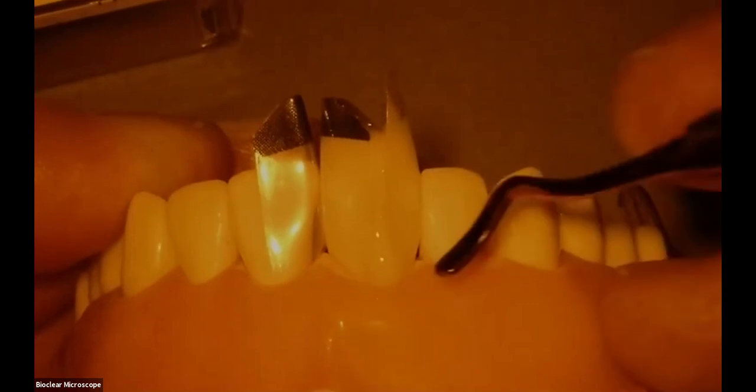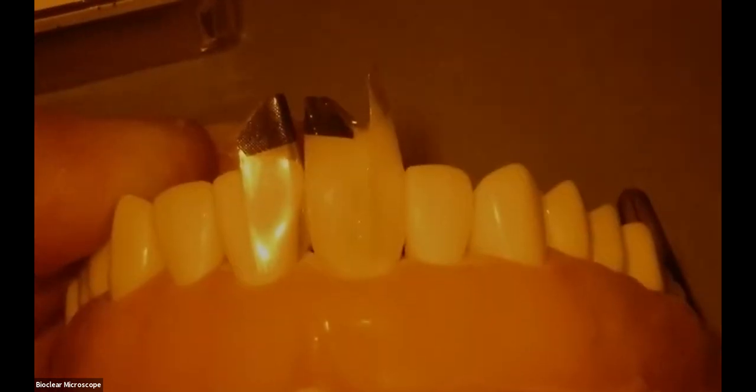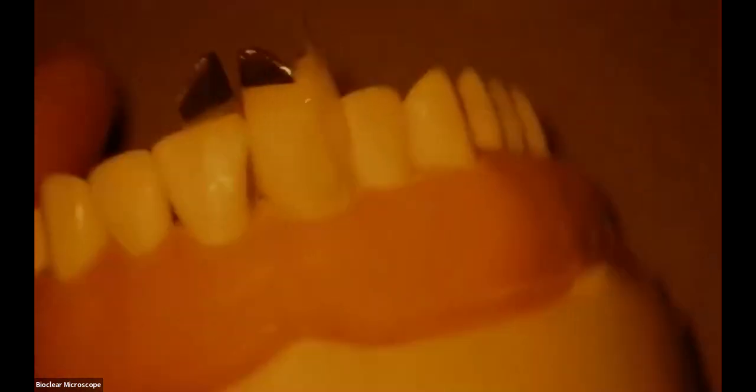I'm going to massage the paste like this, massage like this, and then we'll bring in and gently scoop out any excess on the gingival. We'll scoop away any excess here. Wipe, please. We'll scoop right here. And then clinically, you'll need a dry brush because you'll typically have excess that goes on the wrong side of the matrix there. And dry brush. And then I'll do one more dry brush on the lingual. Move that burr block for a minute before I impale myself again. And we look good. Let's go ahead and cure.